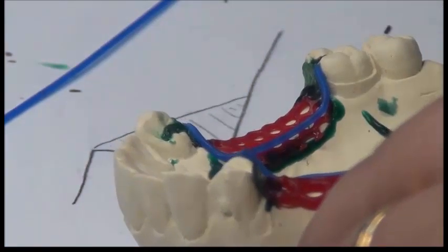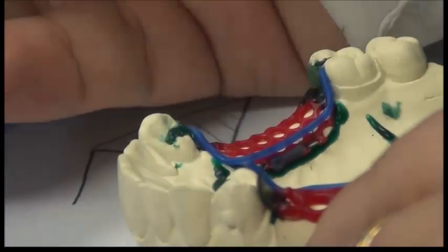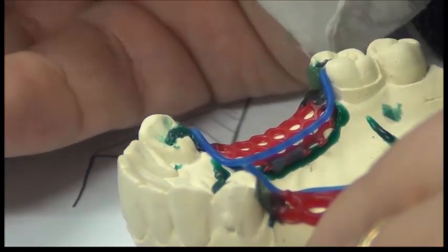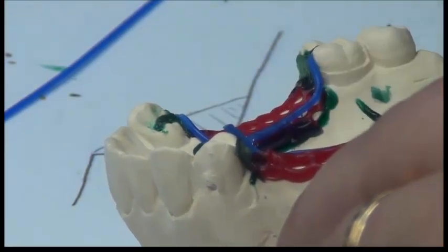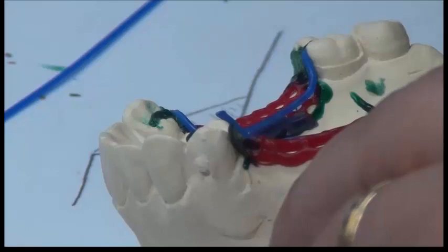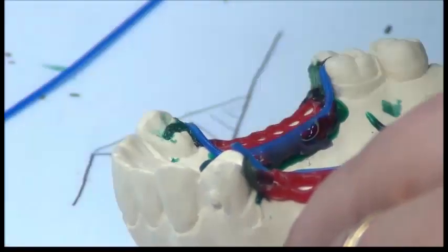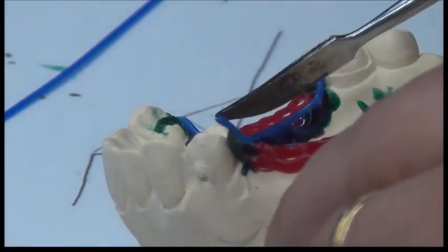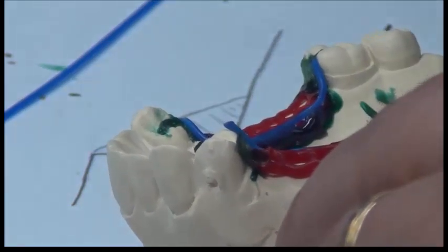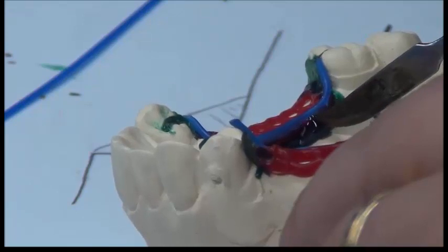Okay, you can see that I'm dripping the wax, new wax. I'm adding a new wax in between the external finish line and the internal finish line. They should be in a wedge shape. I'm trying not to melt down the external finish line I added. The wax you added is very delicate and it's very small, so I try to not melt it down. I'm just adding to it on the external side of it, joining it with the external finish, the internal finish line.